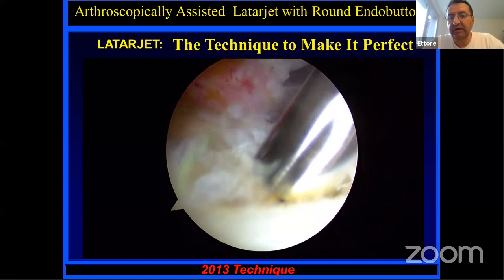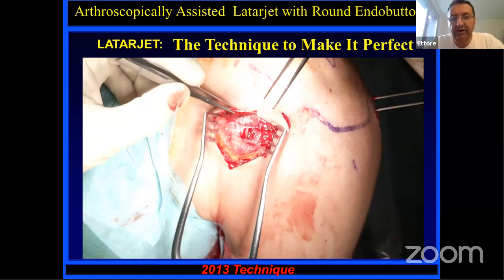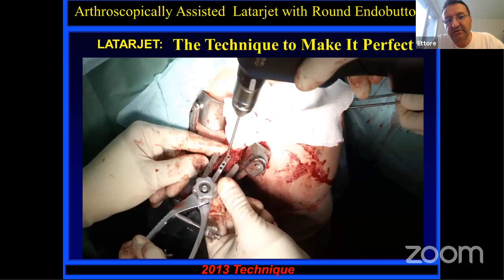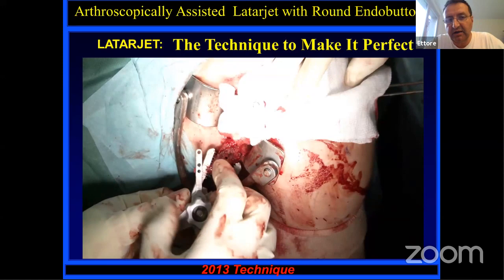Maybe you can prepare the holes for your suture anchor if you want to reconstruct the capsule. And then you just enlarge a little bit your inferior, I'm sorry, there is the volume. Anyway, in this way, you see how precise you can be in preparing the coracoid, diminishing the risk of harvesting the coracoid. And these instruments give you the possibility to do the tunnels in the coracoid exactly at the same distance as the tunnels in the glenoid.